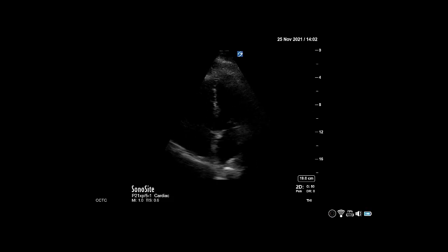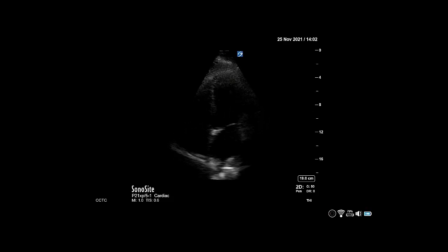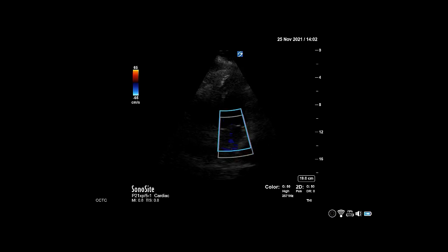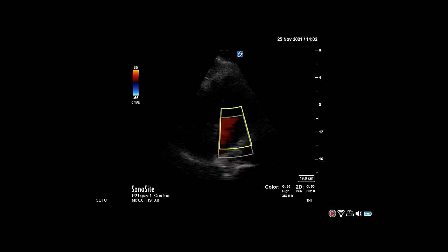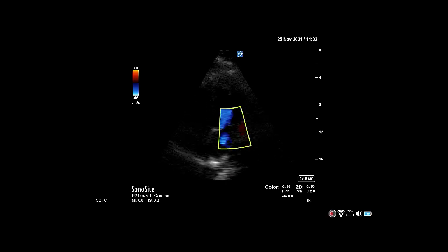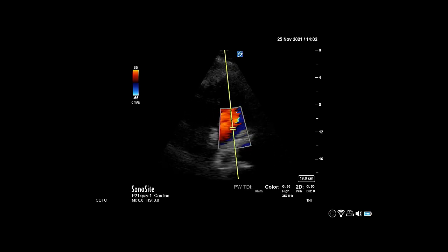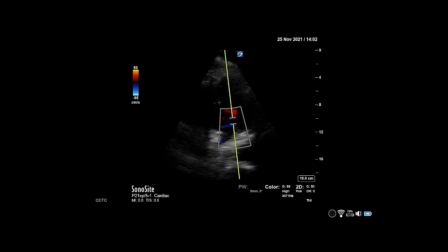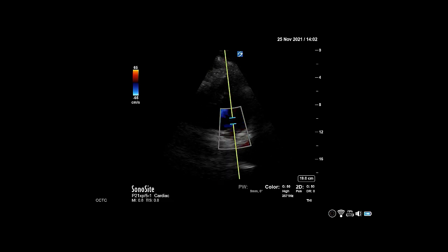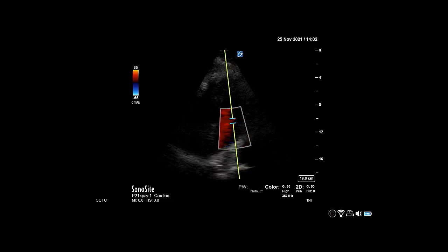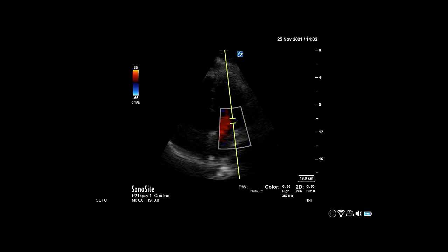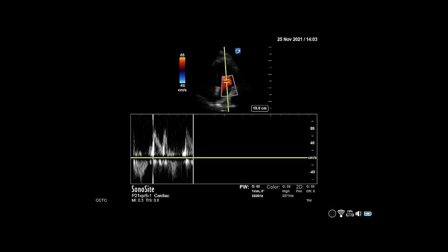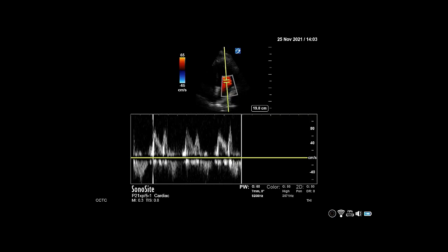Last, to measure the E velocity, place the color box over the mitral valve and inflow. Use pulse wave and place the pulse gate just above the tips of the mitral valve. Pulsing here gives the image at the bottom of the screen. Measure the first positive deflection, which is the E.